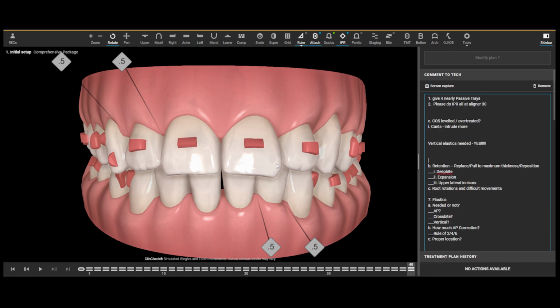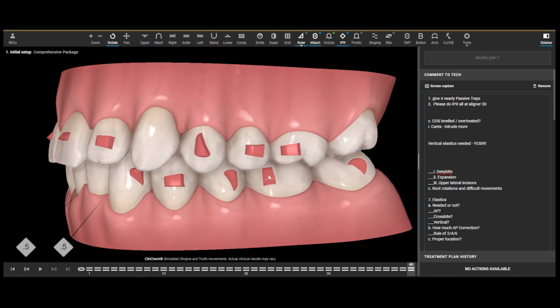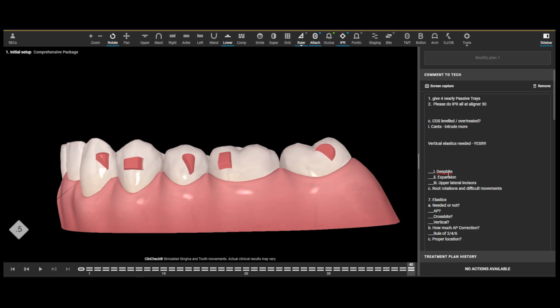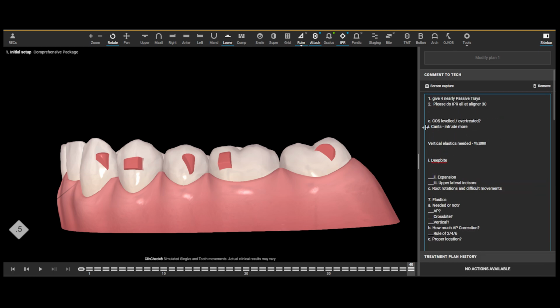Next thing, are there retention attachments required where we need to use them, either moving them around or increasing their thickness for deep bite correction? Well, we did talk about that briefly, that yes, we do need to go ahead and intrude these lower incisors. So we may want to change out some of the attachments on the lower premolars. Those are the teeth that help lock in the attachments when we're working on our lower molars. Now, unfortunately, I can't actually make all of the changes for these attachments right now because this is a completed plan. It won't let me modify version 1 of this plan.